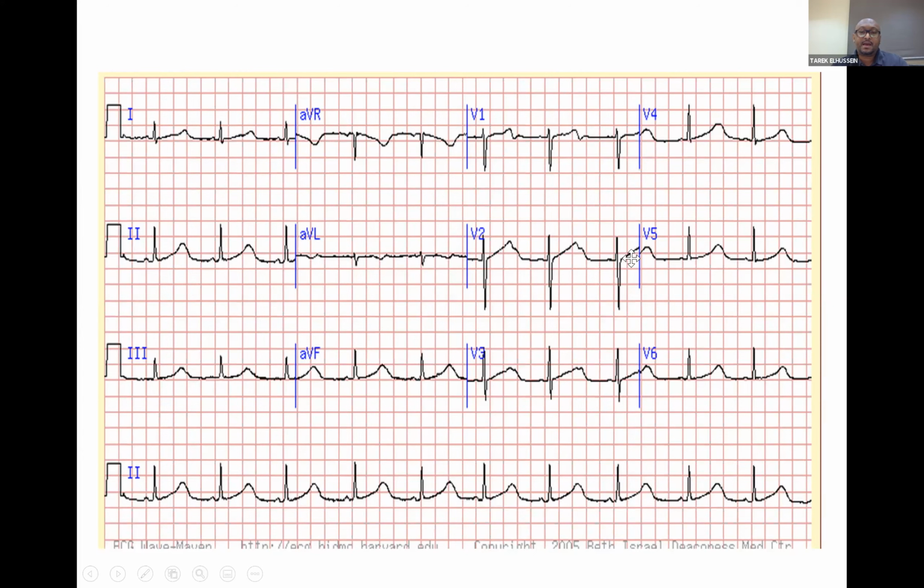Usually, a PAC does not engage within the absolute refractory period within the QT. So most likely you see it in the last 1/3 of the T wave. In the first 1/3 or the second 1/3, usually you will never see a sinus beat. Remember this: a sinus beat will never come. A PAC may fall in, commonly in the last 1/3. However, this deflection we can see only uniform, with a clear hump in the T wave. So this is a U wave.